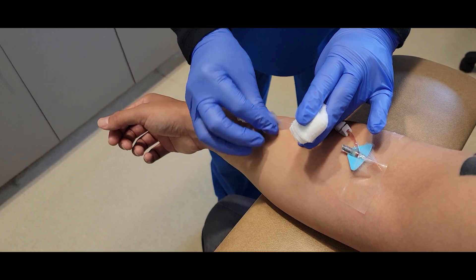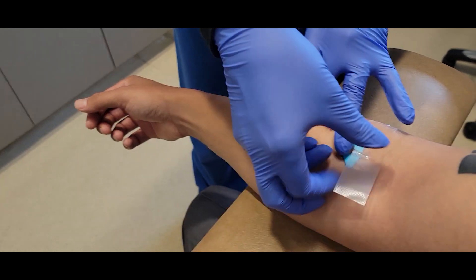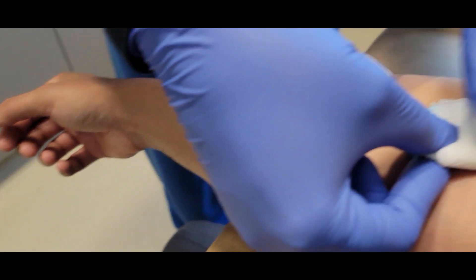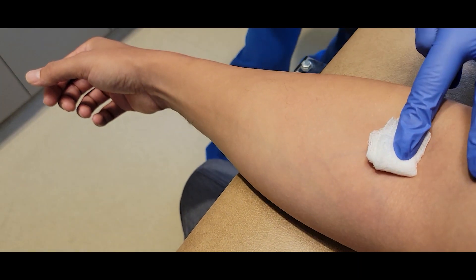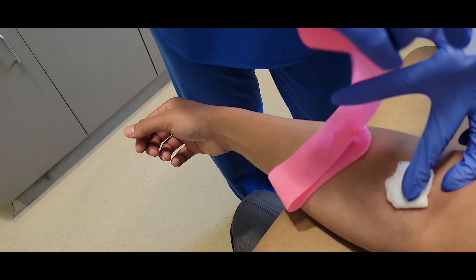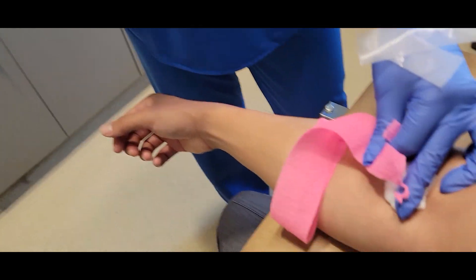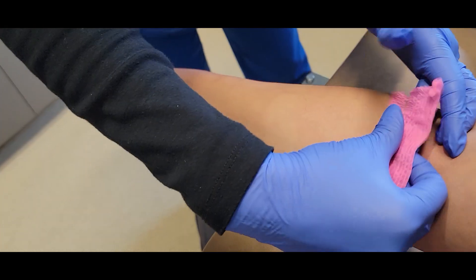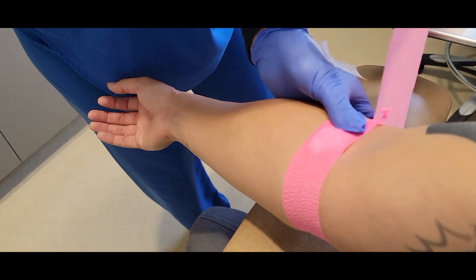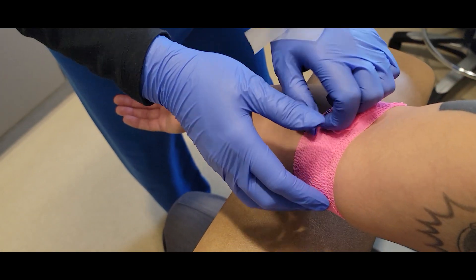Here I'm going to remove the IV — gently pull the tape. Some people have very sensitive skin. And once I've got the tape off, I'm going to put a nice chunk of gauze on there and the catheter slides right out. And I usually have a piece of coflex already ready to go, and I'm going to use that to wrap around the IV injection area. I'm going to wrap it just tight enough that it can apply a little bit of pressure, but not so tight that it's painful.